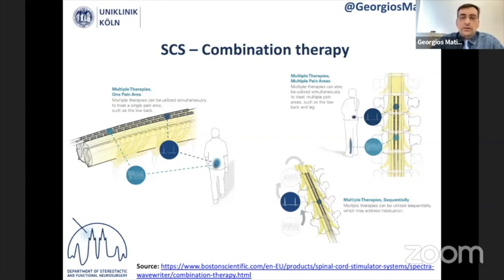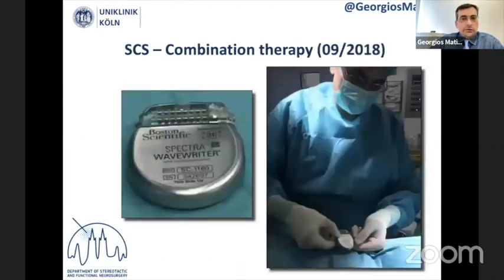The goal here is to address the issue of habituation, or in other words, the issue of loss of efficacy. We all know that in some patients, after some months or years, the pain is even stronger, and we'll have to adapt our stimulation to this pain. This is why it's important to have many waveforms in order to address the issue of habituation.